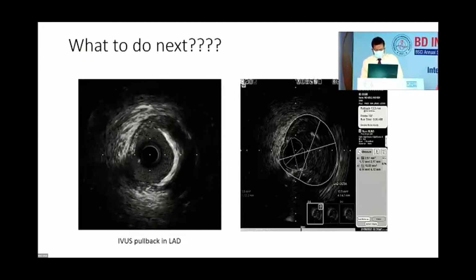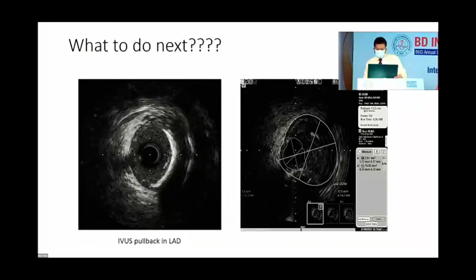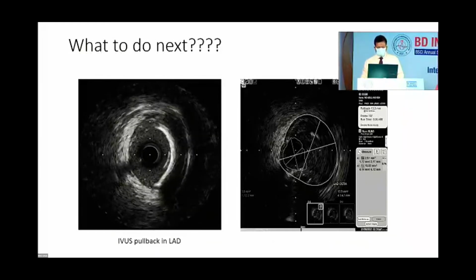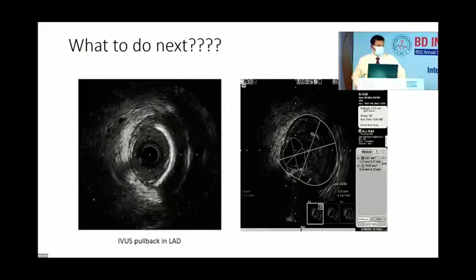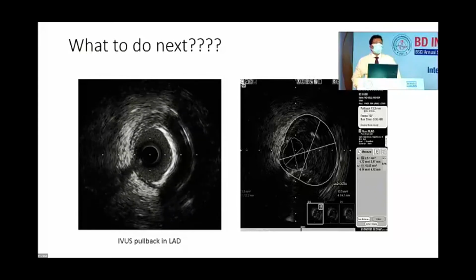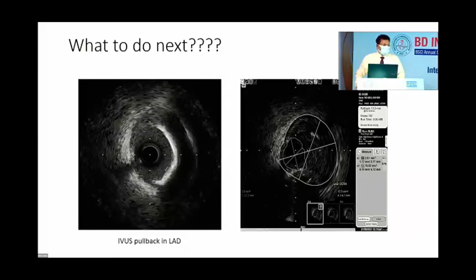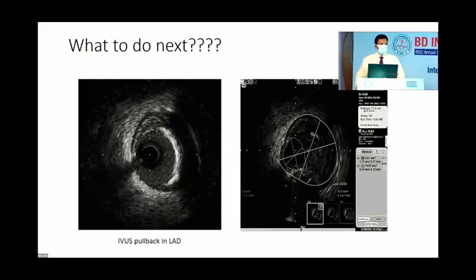This pullback also shows the LAD ostial 3.1 in the LAD ostium, meaning that there is significant narrowing in the LAD.